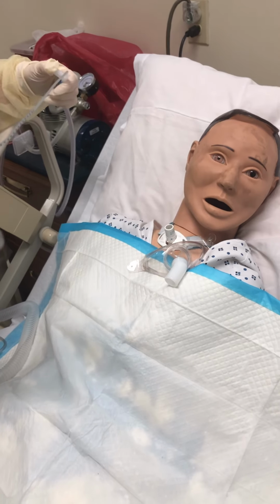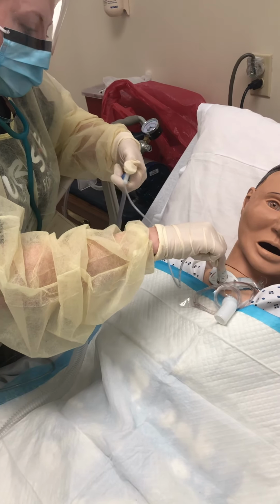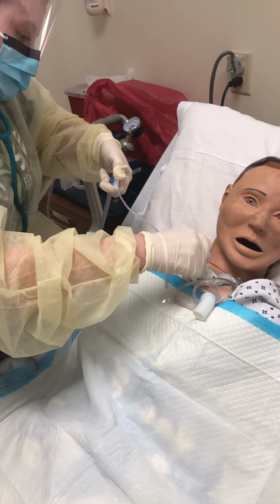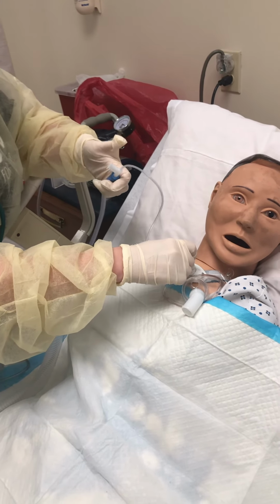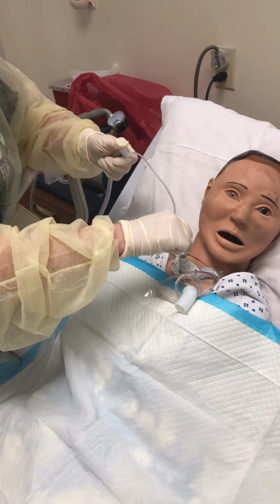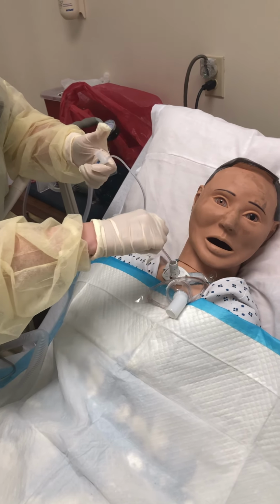I'm going to go down about 4 or 5 inches. Okay. Now I'm going to apply pressure, and I'm going to come out in a circular motion with intermittent suction.